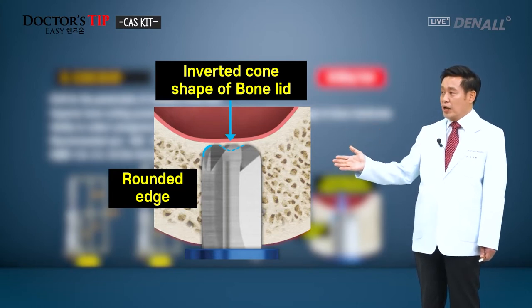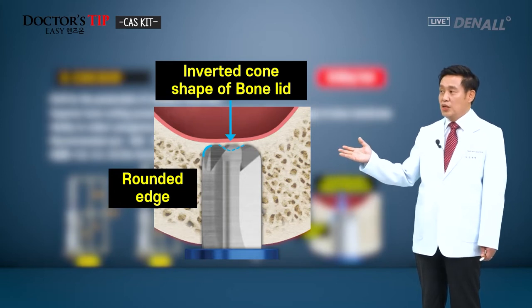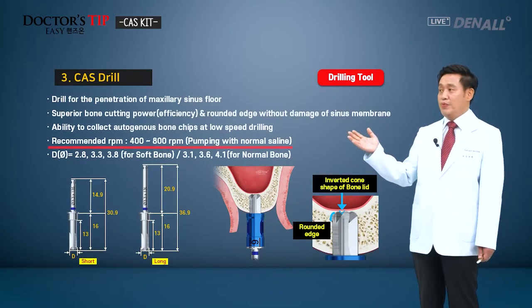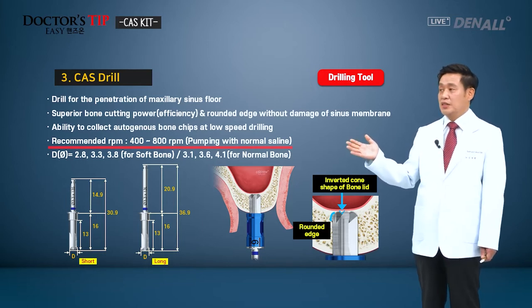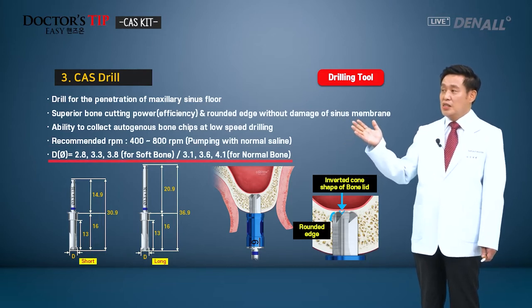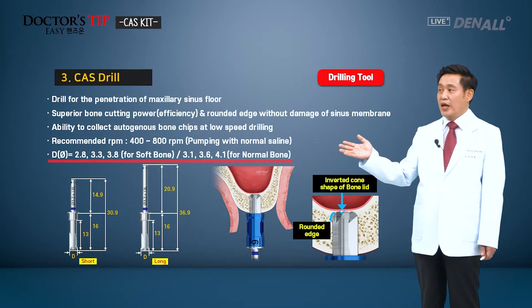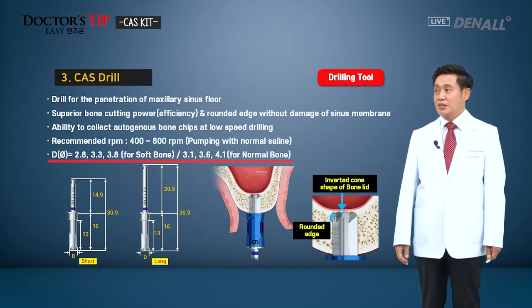Next, if it is drilled at a low speed, the side of the straight drill is designed to collect the autogenous bone chips. The recommended RPM is around 800, then you'll be able to drill easily without problems. There are short ones and long ones. The diameters of the drill are 2.8, 3.3, 3.8 for soft bone, and 3.1, 3.6, and 4.1 for normal bone.